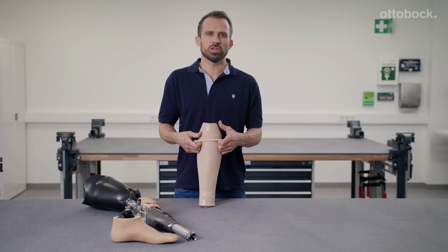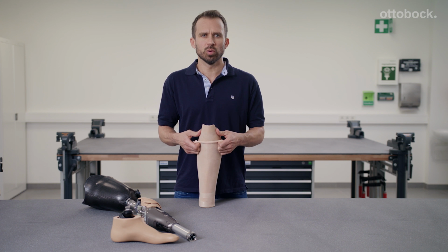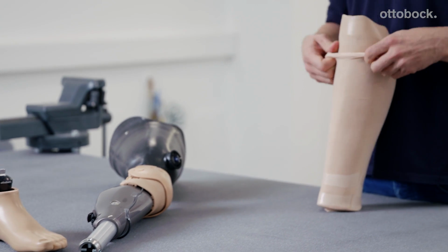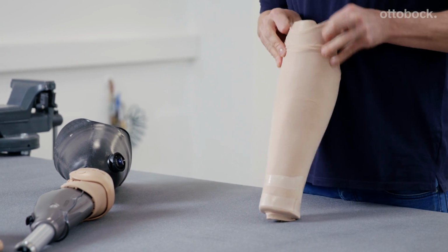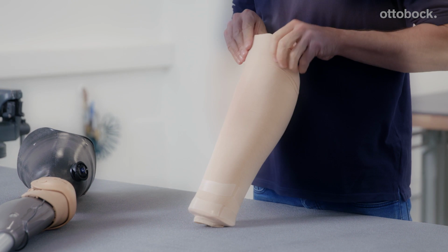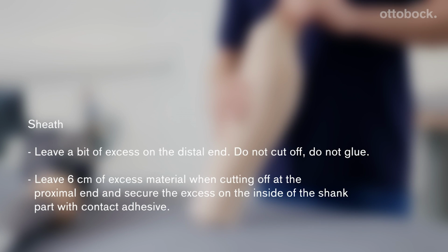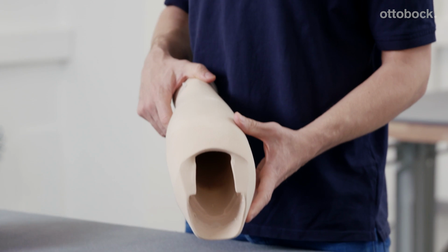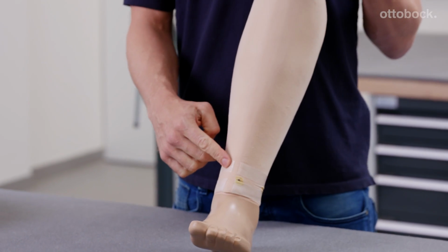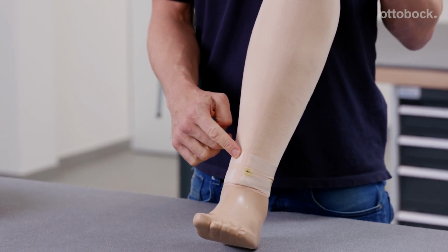Once the sanding of the shank is completed, you have to pull the nylon stocking over it to make it easier to put on the functional stocking later. Secure the holes that you need to make with contact adhesive as well, to avoid ladders.